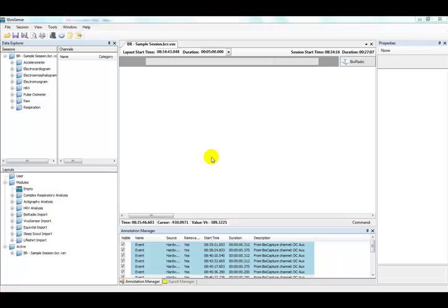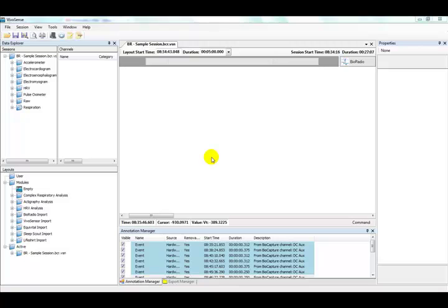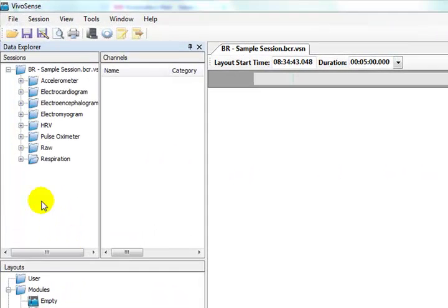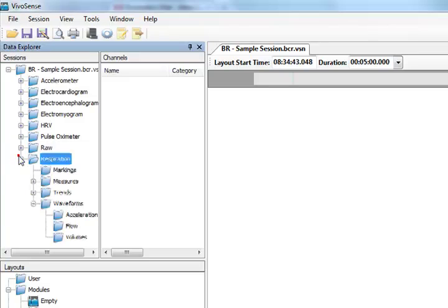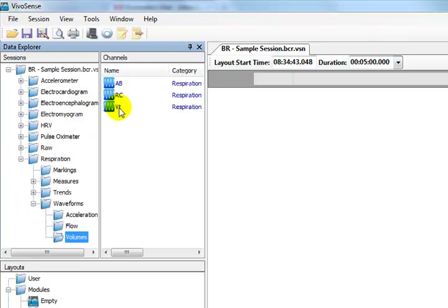We have opened the VivoSense software and imported a hardware file for analysis. Before doing any further complex respiratory analysis, we should first calibrate the volume of the measurements accurately. The qualitative diagnostic calibration can be done automatically or manually using either the tidal volume waveform, minute ventilation, or inspiration volume channels. We can start by adding the tidal volume channel VT to the synchronized chart panel.